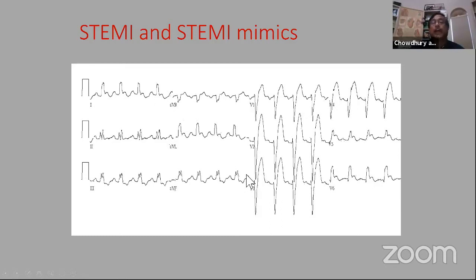Yeah. So the patient has 10 out of 10 chest pain. So this patient has an ongoing ST elevation MI. So this is obvious. I just wanted to bring that example so that you know.